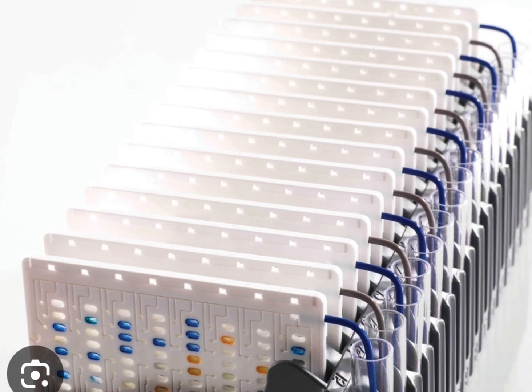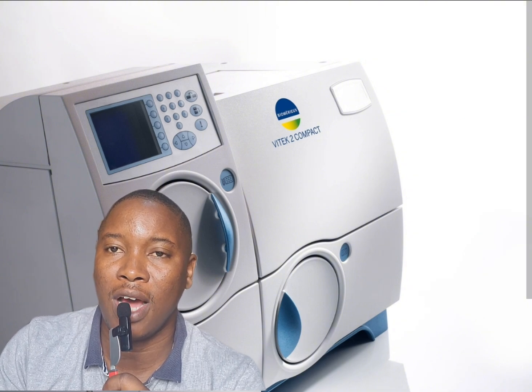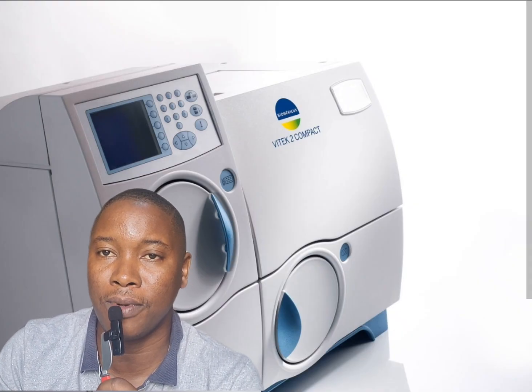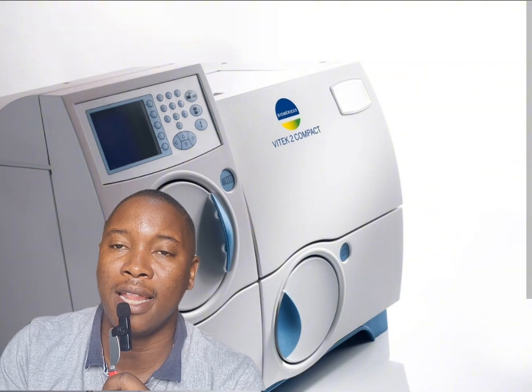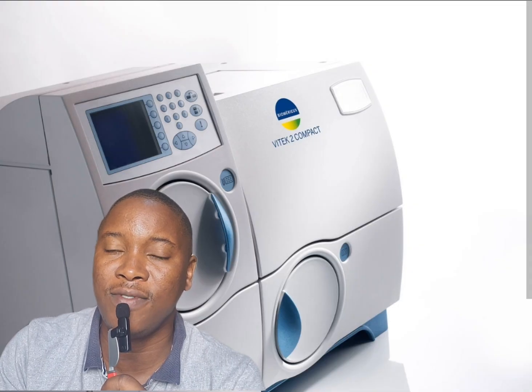Now, you take these microorganisms and then put them into different wells which are present on the ID cards. The idea is that these different wells carry different biochemical agents, carrying different chemicals, so that the machine is able to help you to identify these microorganisms by itself. So you have these wells, you feed your sample microorganism which you are interested in testing into these wells, and then you put it into the machine and run the machine for about 16 to 18 hours, and the machine then gives you the identity of this organism.